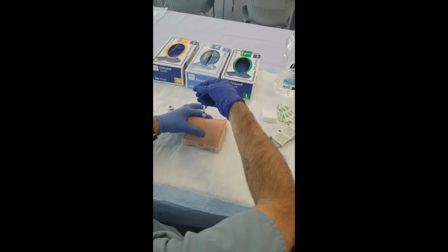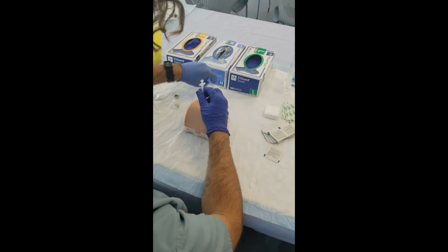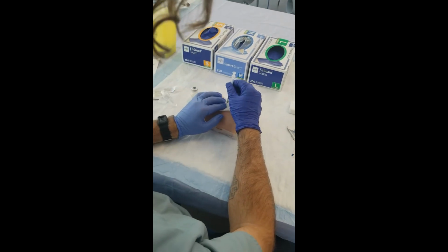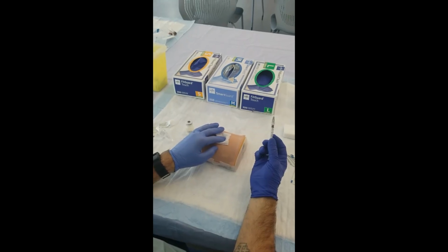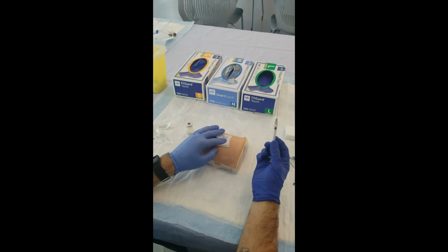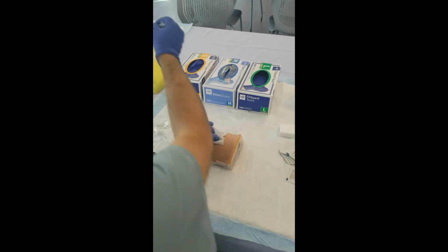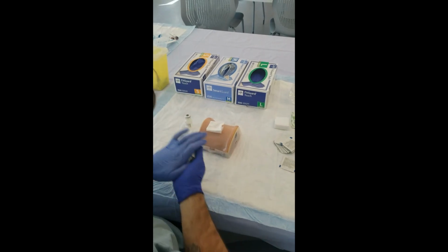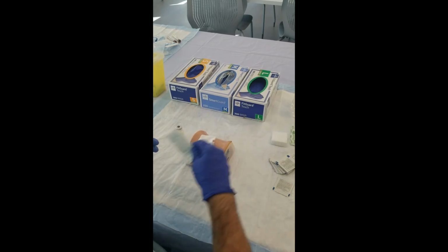Step 41. Removed needle using a 2x2 gauze and applied slight pressure. Items 42 through 45 can be done in any order. Step 42. Disposed of supplies safely and appropriately. Step 43. Place Band-Aid on site.